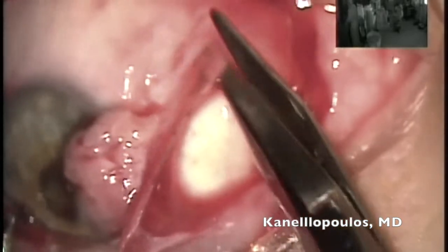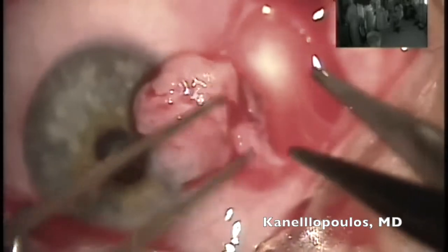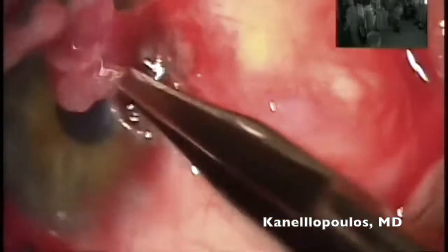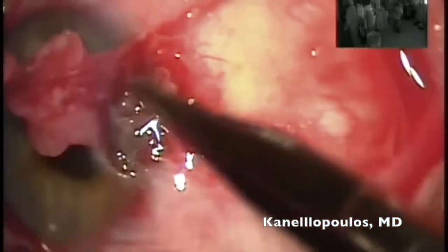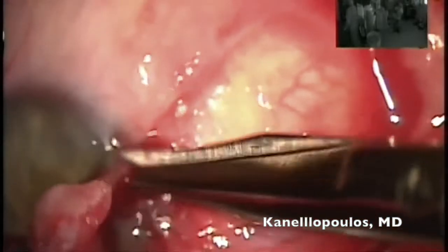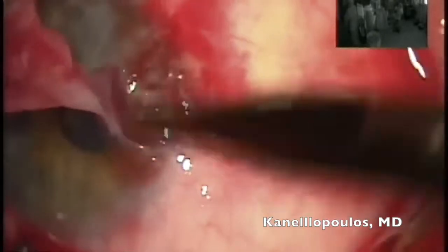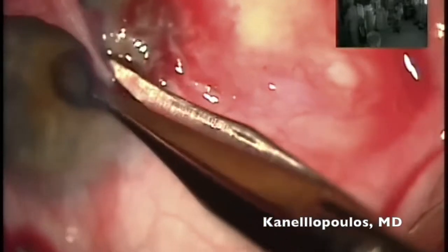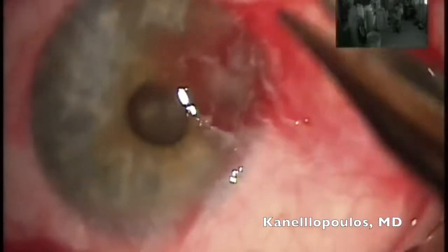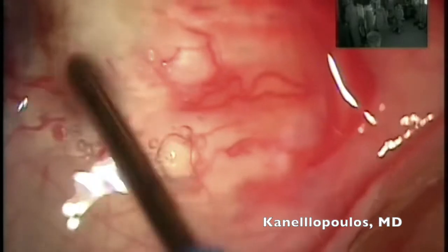You can kind of see the fibers of the medial rectus muscle there. Here I'm removing Tenon's capsule as well, and using the blunt Westcott scissors to trim. You can pull this off, but sometimes parts of the head of the pterygium may be left behind. So I'm meticulously going in there — we can see how the pterygium is fed with vessels all the way into the cornea, and unfortunately it erodes the superior layers of the cornea, Bowman's layer for sure.